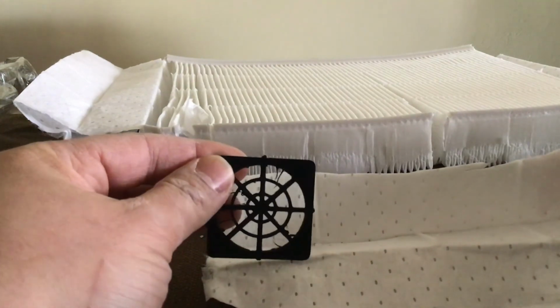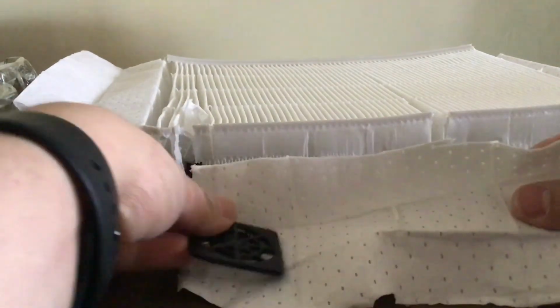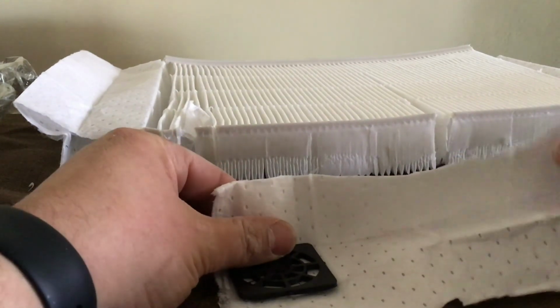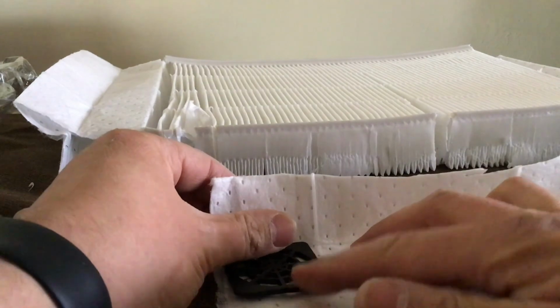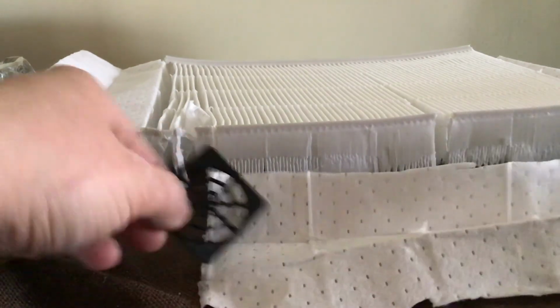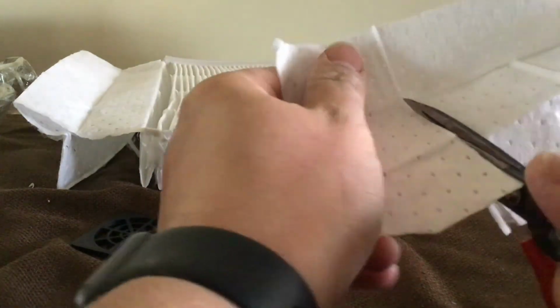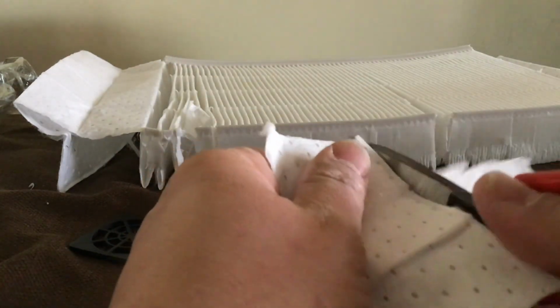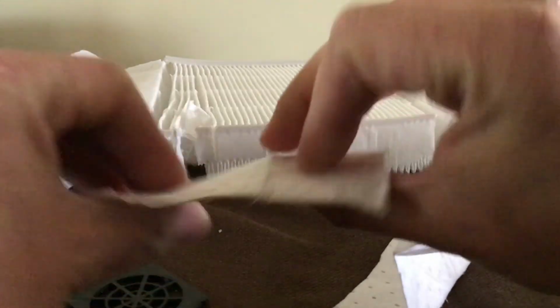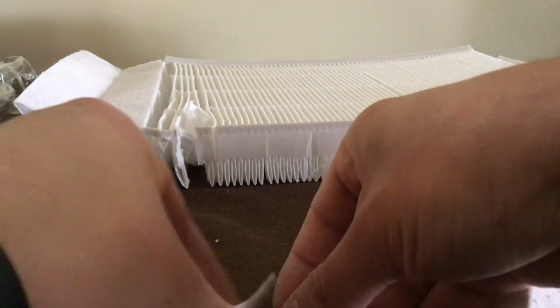Alright, so here we have the insert for one of our modular respirators. And here we have the HEPA filter we'll be wrapping it with. So, as you can see, pretty much cut to the glue lines on this particular filter style, and you'll have a nice piece that's pretty much exactly the width that we need. So we will cut from here. Then take this, and we're going to take it so that the soft side here is folded inwards. So folded like this.